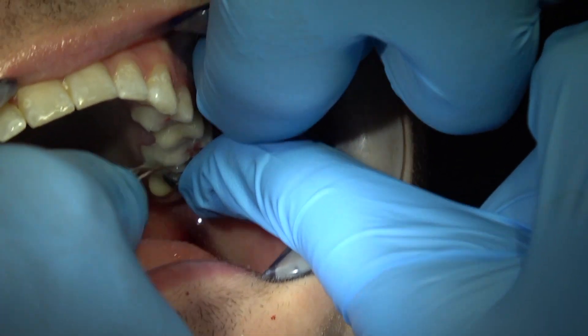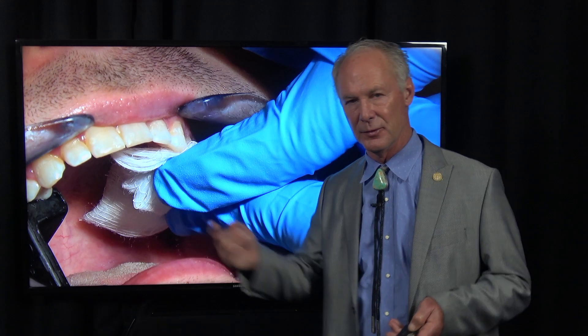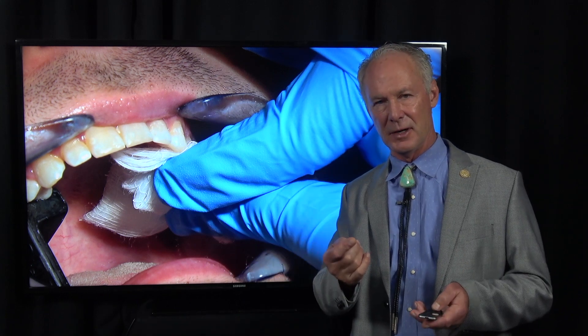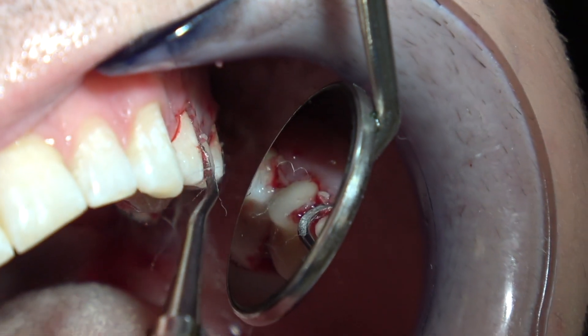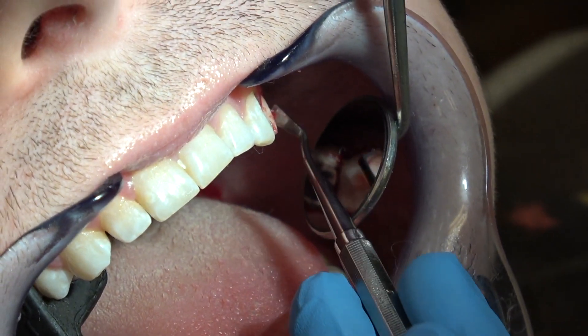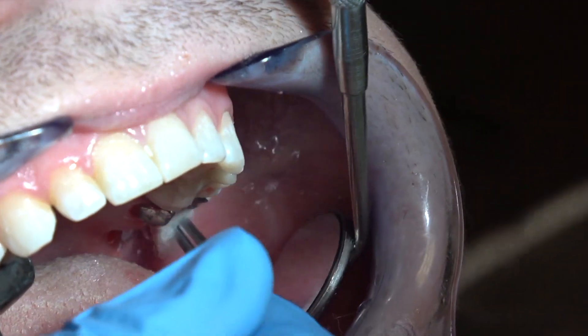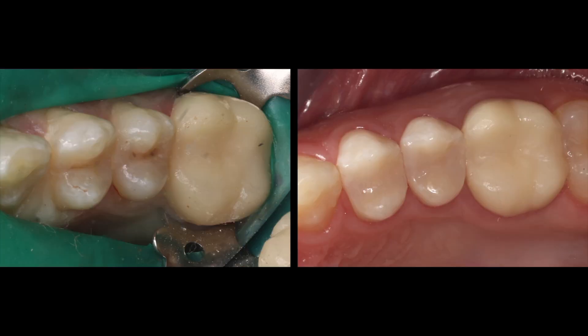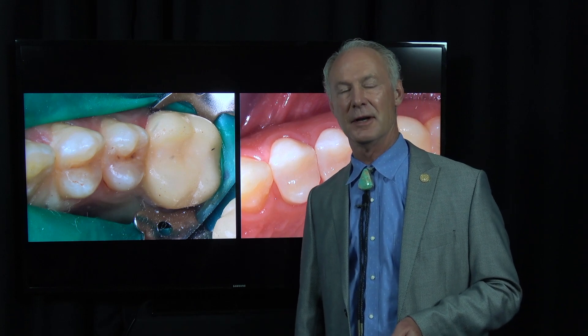We're popping the contacts with waxed floss before we seat the crowns. When trying them on, we check with unwaxed floss because we want it to break if it's too tight. Using the back edge of the scaler — it's going to bleed once you start removing excess cement, but that's okay because the crown is seated and sealed. Here are the final restorations on that side, and here are the final restorations on this side. That's the Dental Minute — these techniques work and they work every time.